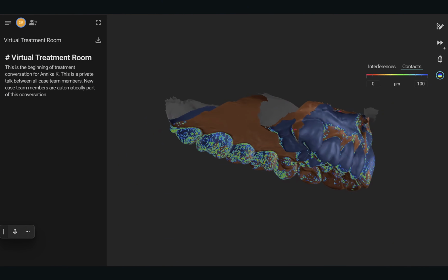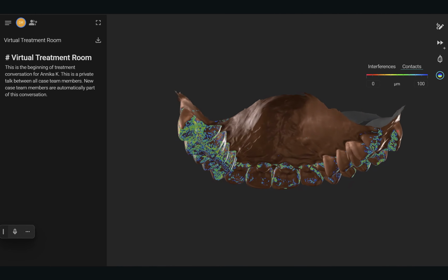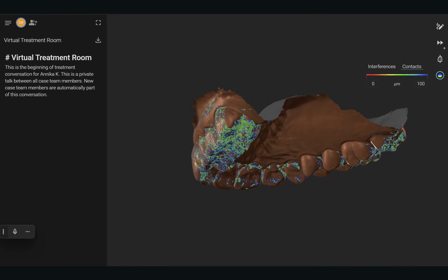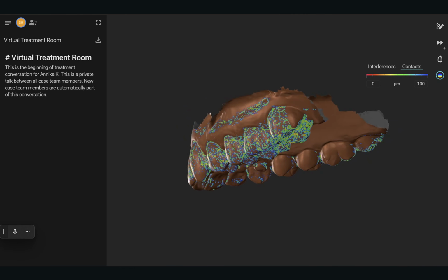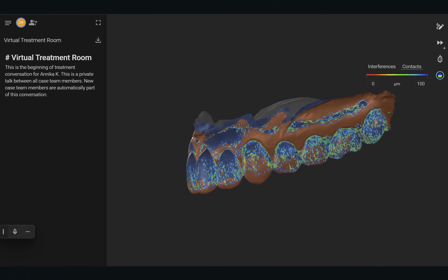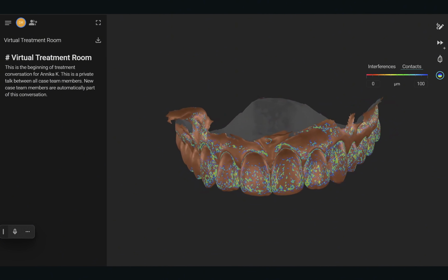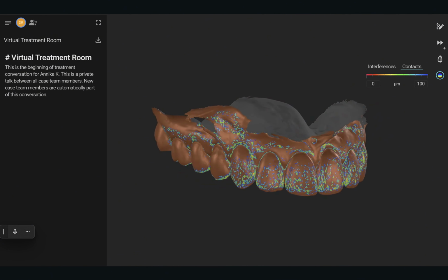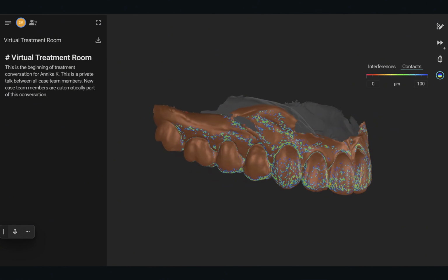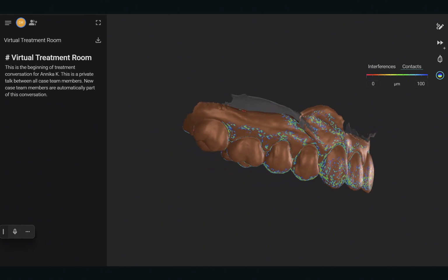I could tell down to the micron level that no, it was the same. It was fine. And in fact, if anything, she had been not wearing her aligner retainer of an evening, because I could see that quadrant 1 had shifted and had lost a bit of the expansion we'd built over time.